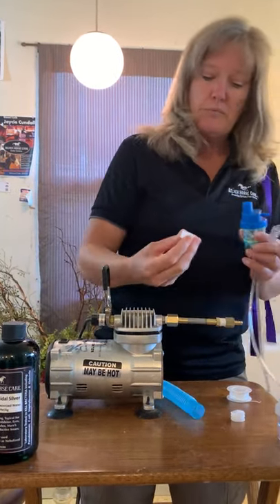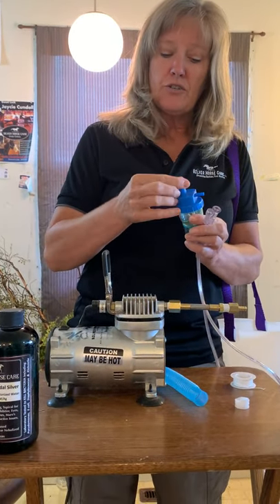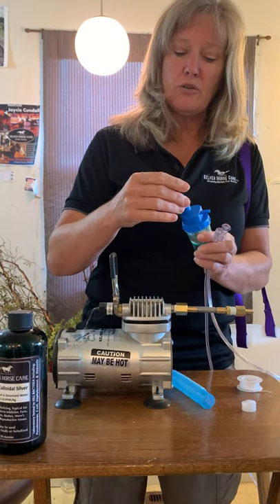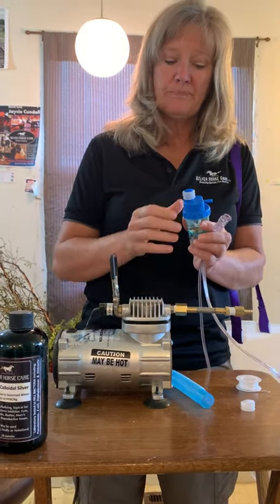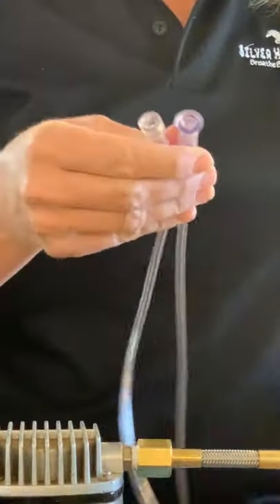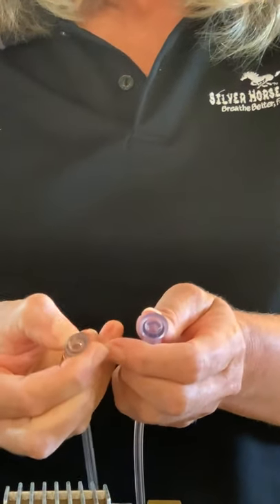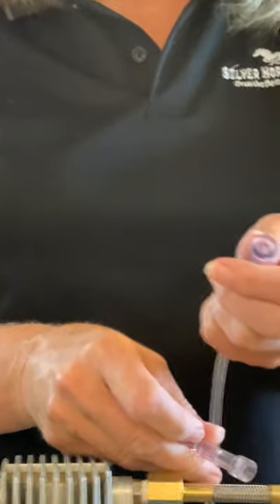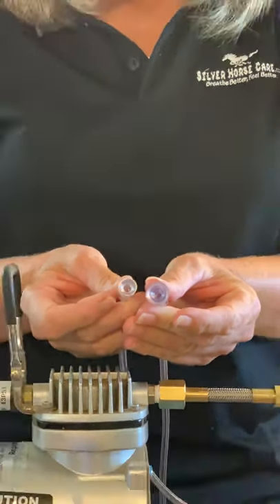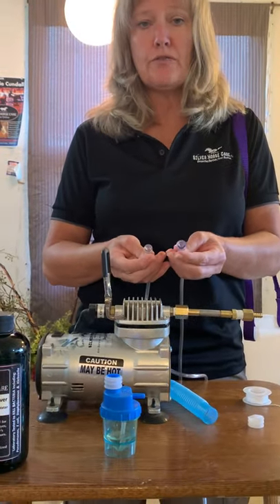Now the next thing we're going to do is take a ring adapter. There's a thicker part, and that's what goes on first. If you try and shove it on, you're going to have trouble getting it off. So you want to put that end on, and then you've got two ends to your oxygen tube. It is 7 foot — this is what comes with our kits. There's one end that's softer, and that's what goes to the compressor, and then there's a thicker end that goes to the medicine cup.